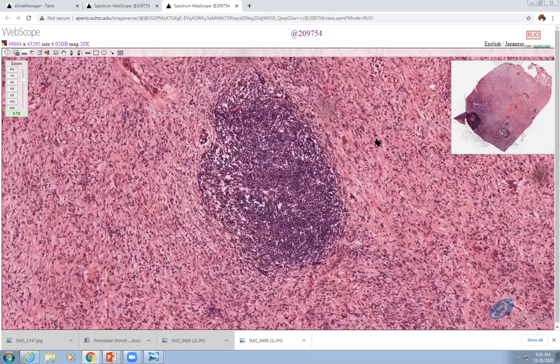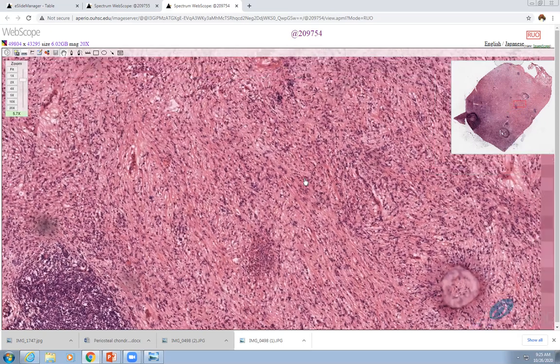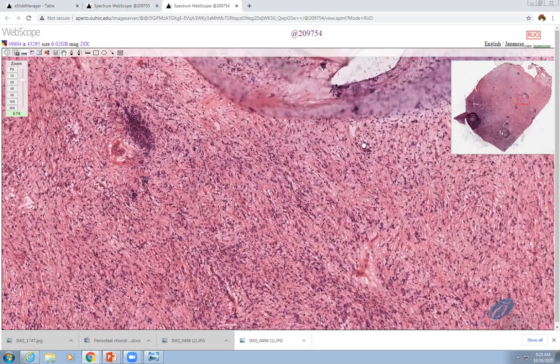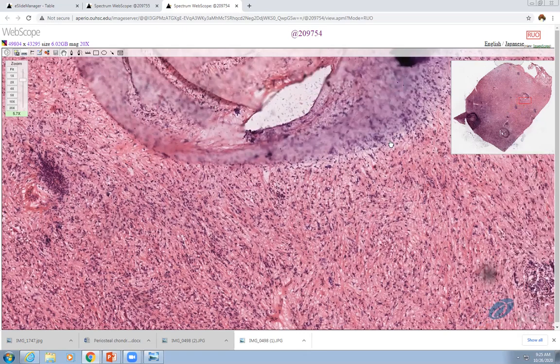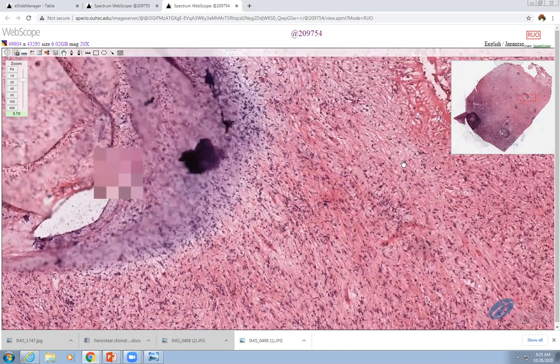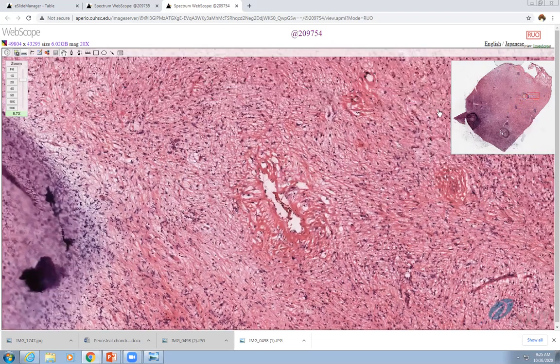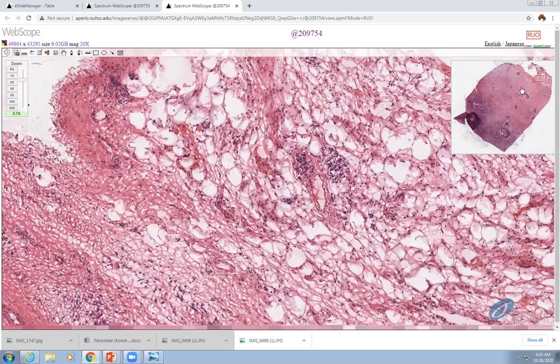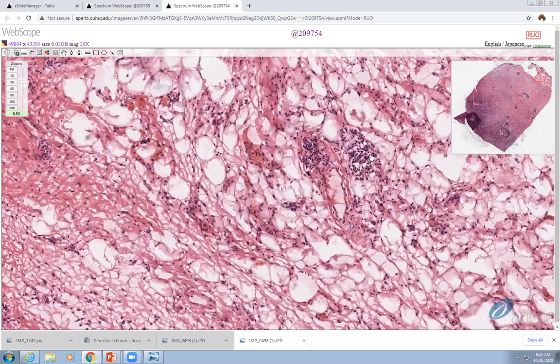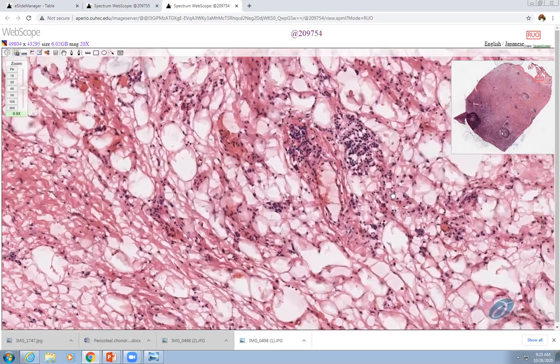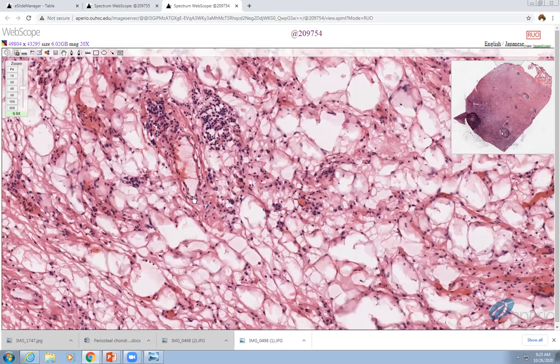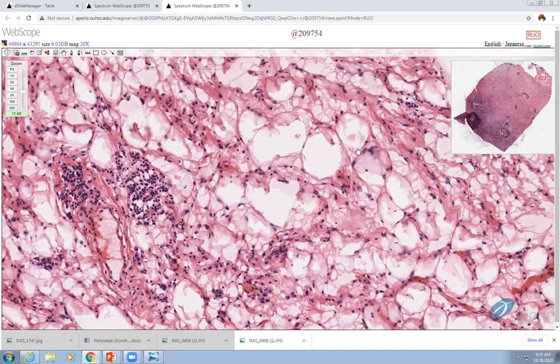Looking at the periphery of this lesion, we can see that the spindle cell population is not highly cellular, not highly pleomorphic, but it's certainly atypical. As we come to the periphery, we can see a border of fatty tissue here. Looking at this more closely, we don't see a huge degree of atypia, although there are a few atypical cells in the fatty tissue.